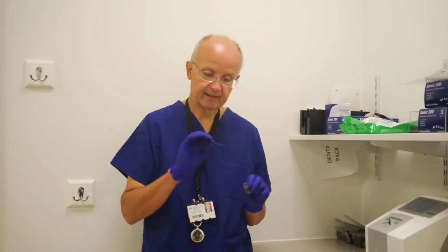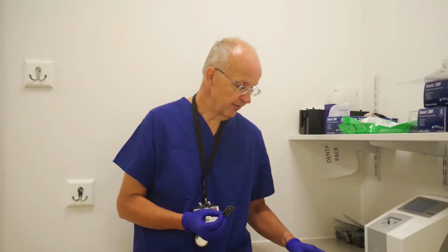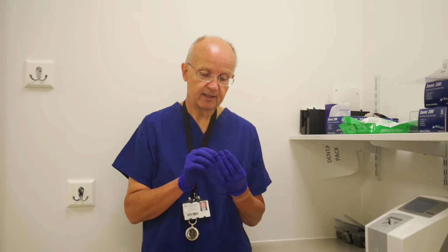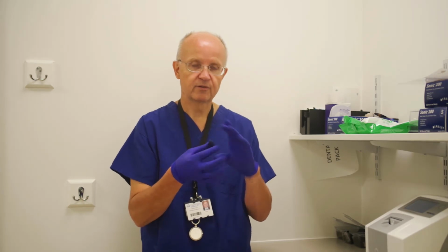Now these ones are very handily numbered on the back. You can probably see that says 2. So if you're in any doubt, just look at the back of the plate. The other thing the back of the plate will tell you is that it is the back. On there is the little word back, and that's really, really important because the phosphor is on that side, as you can see, and that is light sensitive.